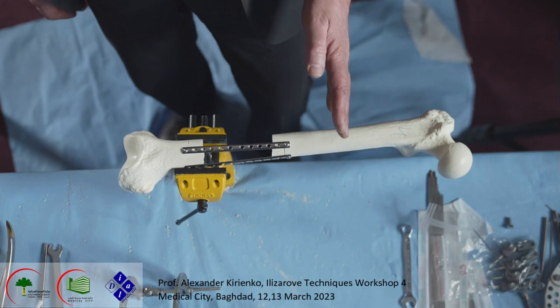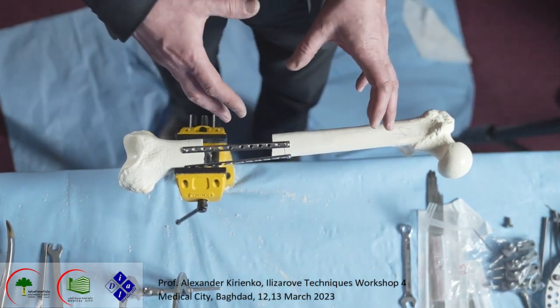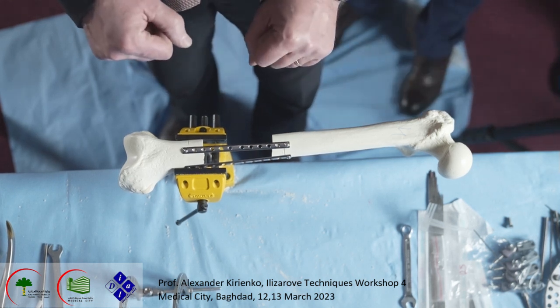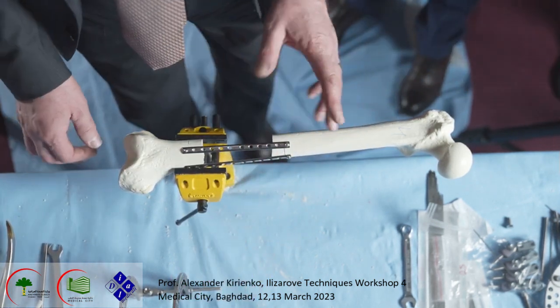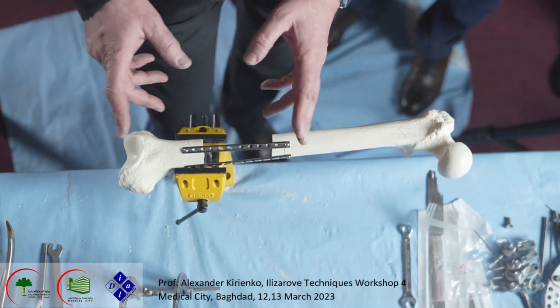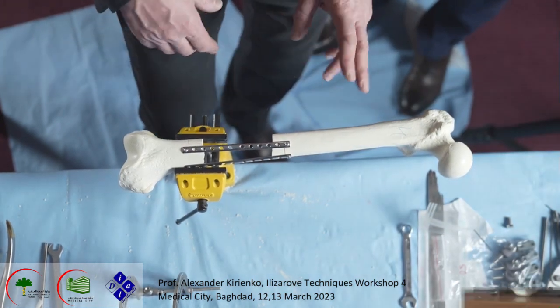I have the initial part of the frame built on the femur, in a way that I may manipulate the bone better than if everything were free. For this reason, we start by applying the proximal system to the femur, and after that we do the distal part of the femur.